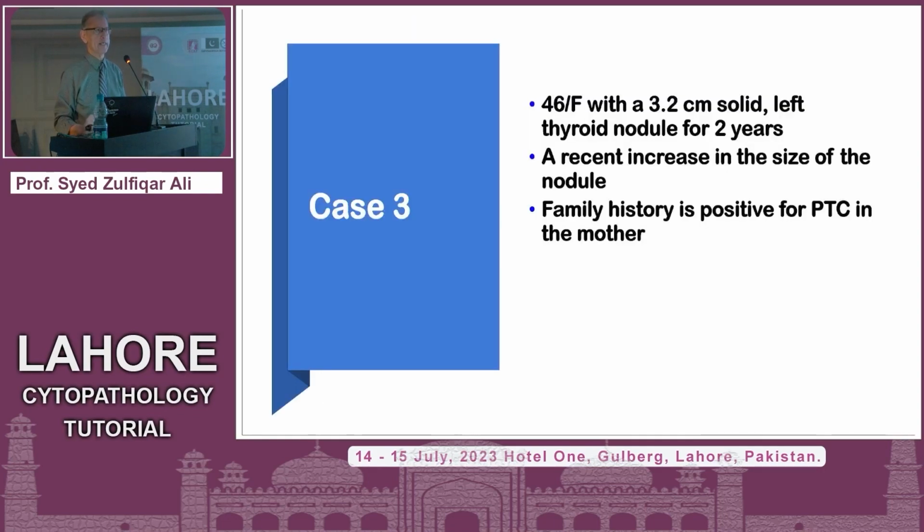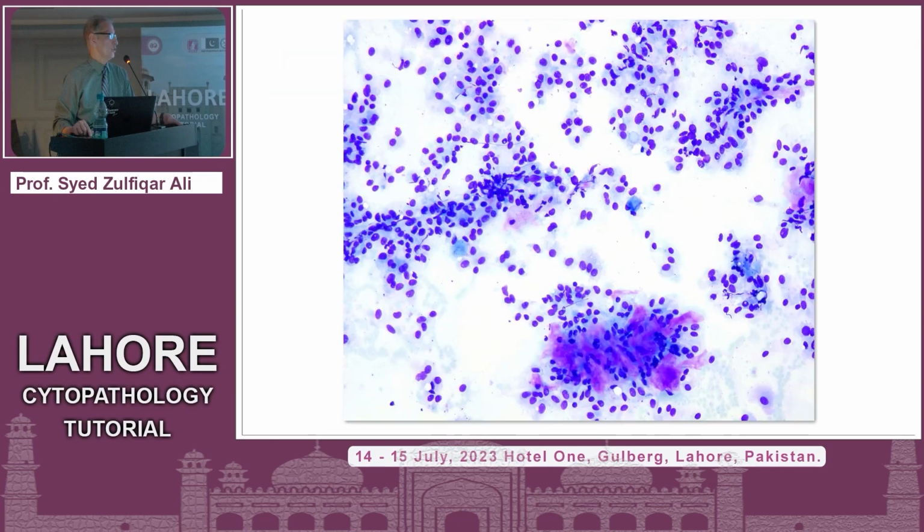So case 3, very quickly, a 46-year-old female who has a 3.2 centimeter solid left thyroid nodule, which is present for 2 years. And once again, I'm so generous with the history. I'm already telling you the diagnosis is positive for papillary thyroid carcinoma in the mother. So strong family history. So Hassan is looking at me, wondering if I'm just bluffing or giving you the right history, but that's the appearance of the lesion.